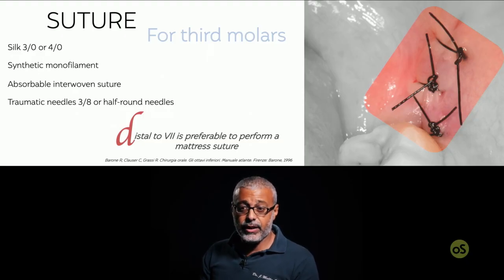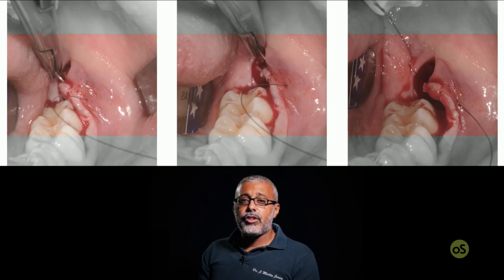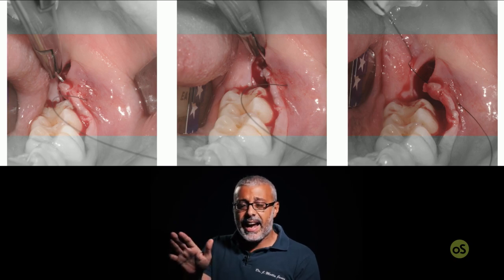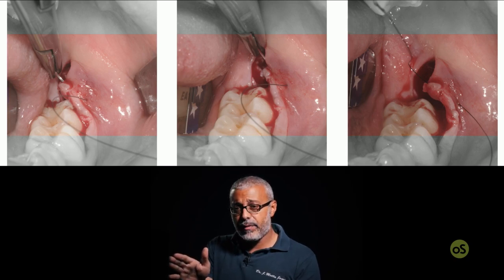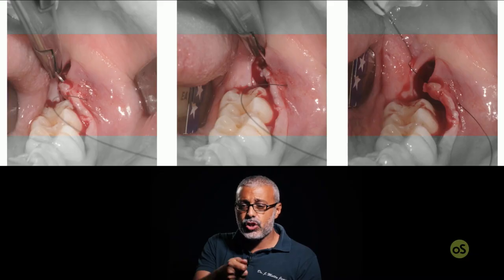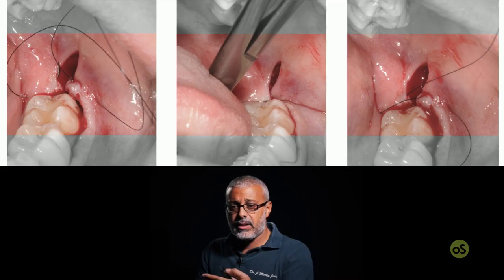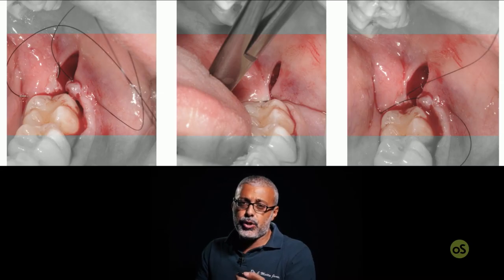figure of the needle. The first suture I apply is like a mattress suture, where you see I enter the buccal aspect of the flap, I get my suture on the lingual aspect, I then enter on the lingual aspect of the flap, which was not elevated.